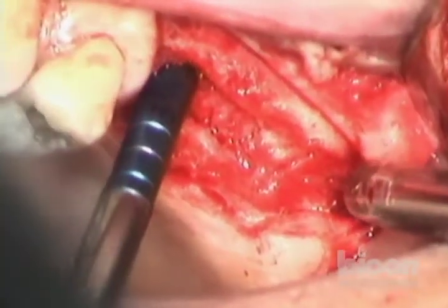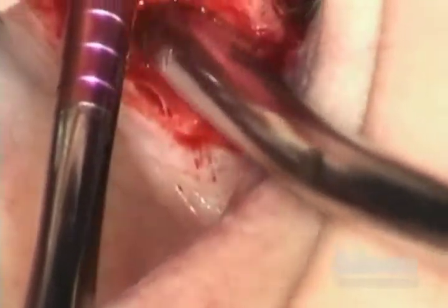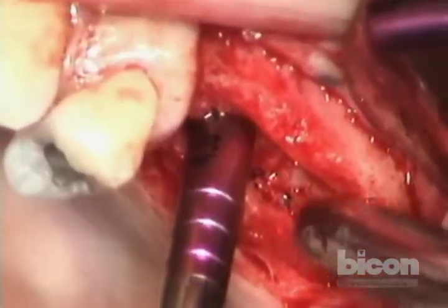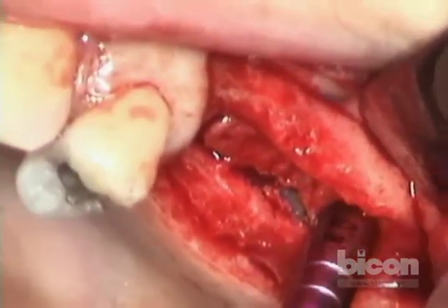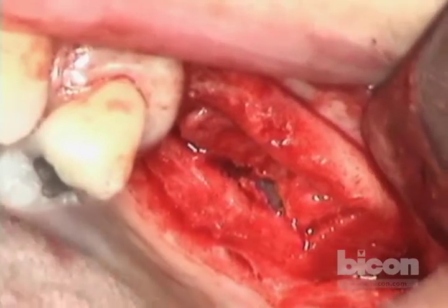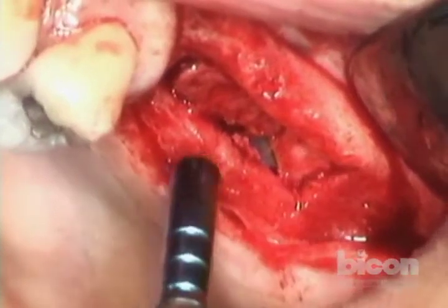Now I'm going to switch to a wider one — the four millimeters. We're going to continue that. The idea is you have to do it very slowly, because the time elapsing between the initial mobilization and the completion of the elevation allows for a tiny amount of swelling to infiltrate the adventitia of the sinus mucosal lining, thereby allowing you to lift it up a little more easily.